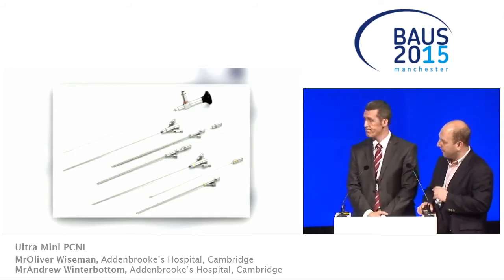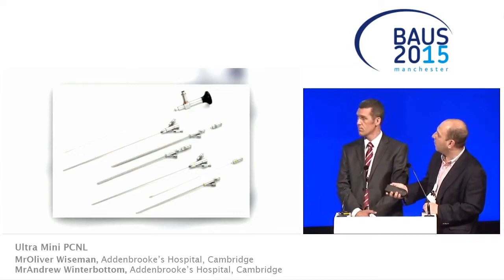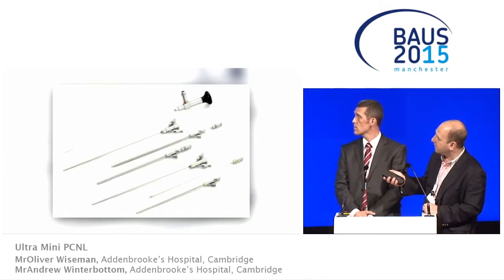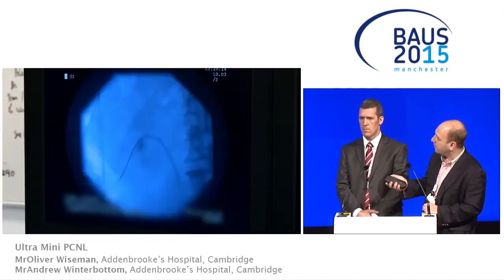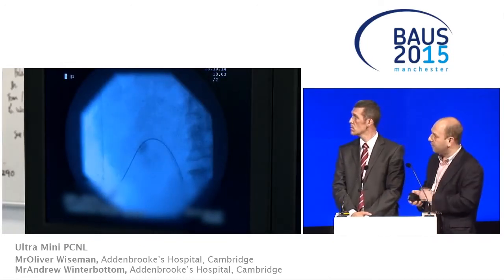Thanks. I'll take you through the kit now, because many of you won't have seen this. This is a 1 millimeter scope which goes into the inner sheath, and the inner sheath has the scope which goes in the middle here, and then two side ports, one of which is for irrigation and one of which your laser fiber goes down. That will then fit through your outer sheath, which comes in two sizes, and there's an obturator which you basically use to get the access.